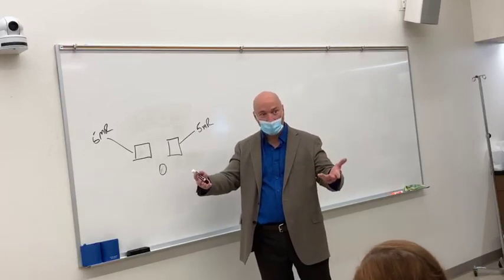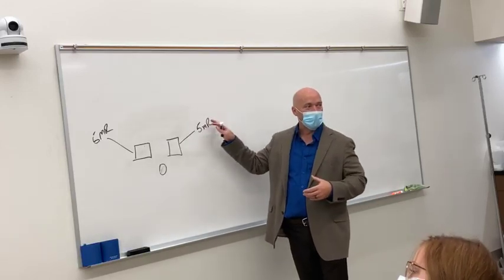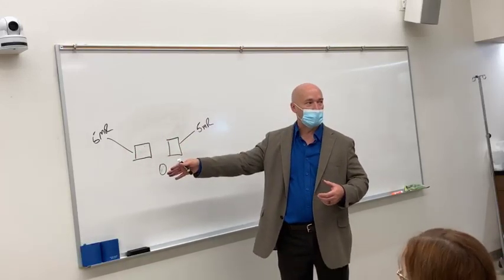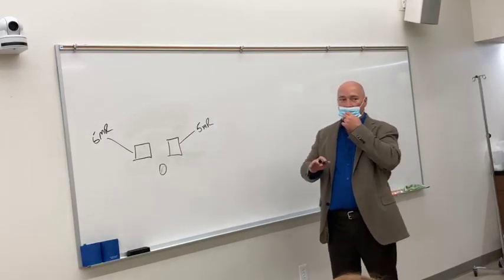what's the second part of that? Phototimers. Photocells, phototimers, that's what we call them, phototimers, because they're going to terminate the exposure based on just what they're preset to terminate the exposure for. Okay? So if you've got a larger patient, a bigger patient, you shouldn't have to adjust anything.